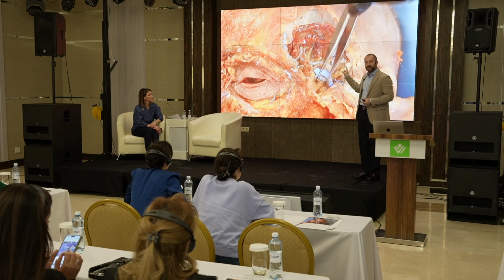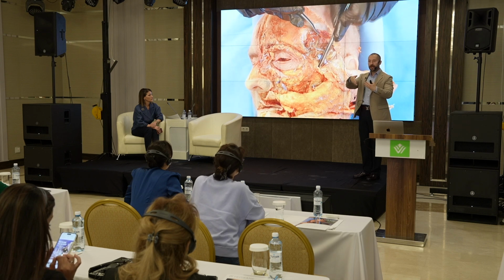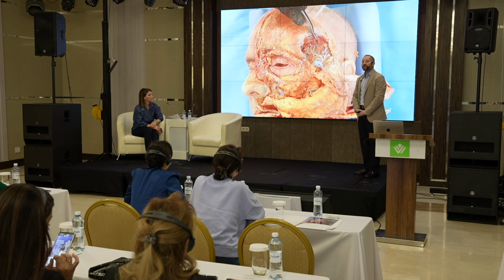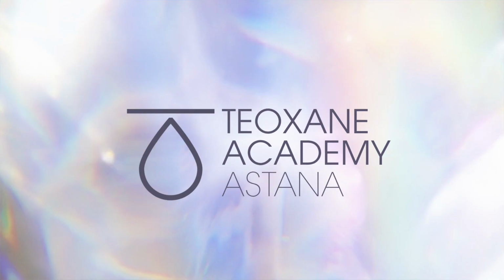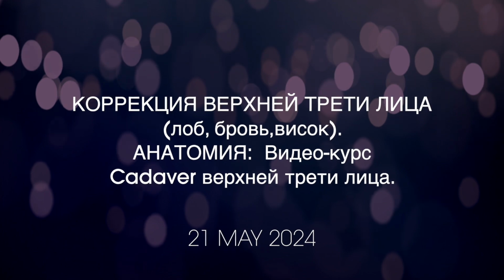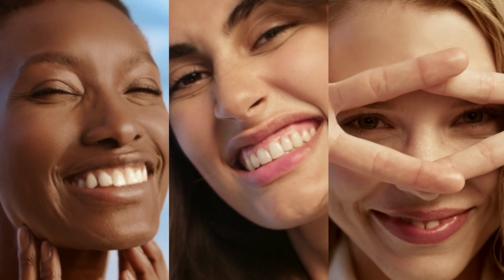Here, you can see, I told you, in this layer, deep to the deep fascia and superficial to the muscle, your product can easily slide to the buccal fat. And you can see it's a very vascular area. These are the middle temporal veins and arteries in the superficial part of the muscle. When you remove the muscle, there is no empty space directly to the bone, and these are the deep temporal arteries inside the muscle. When you are close to the orbital rim, it's safer for the gunshot technique because these arteries are a little bit in the back part of the temple area.